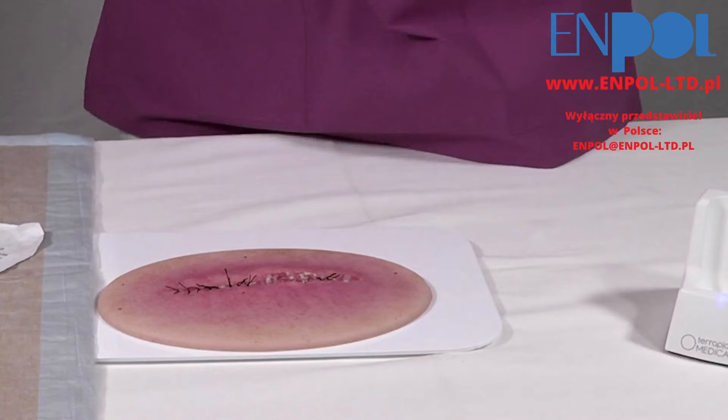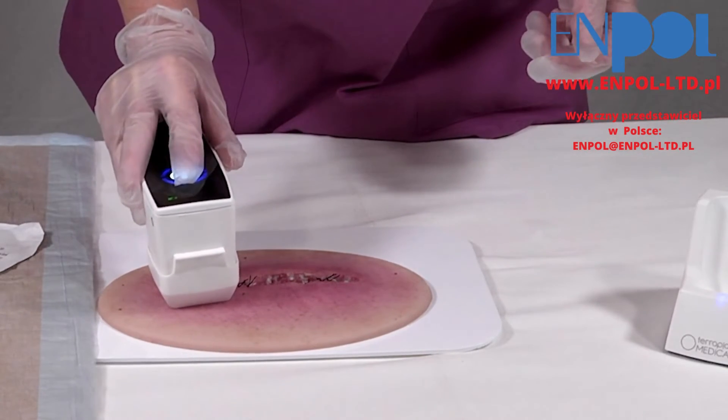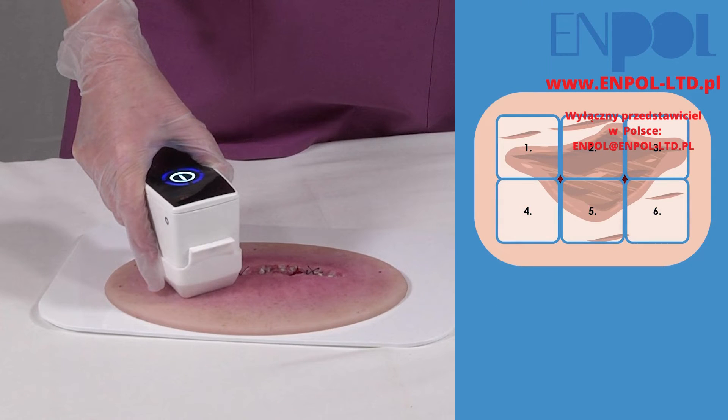Place the spacer-equipped head of the device directly on the wound and start treatment by pressing the touch button. After 60 seconds, a therapy cycle is completed and the device stops.